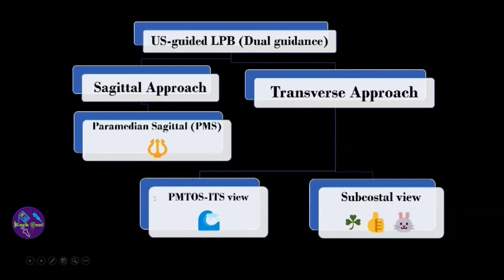These are the sonographic patterns you need to remember while scanning for the ultrasound-guided lumbar plexus. The trident sign is associated with the paramedian sagittal, the wave sign with the PMTOS, and the shamrock thumbs-up or bunny head sign with the subcostal view.